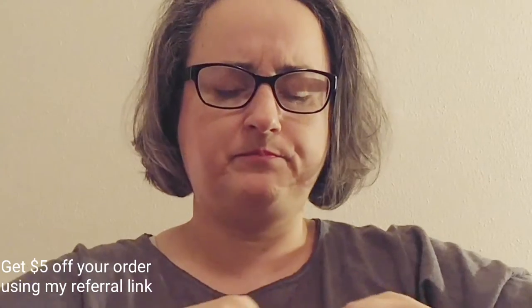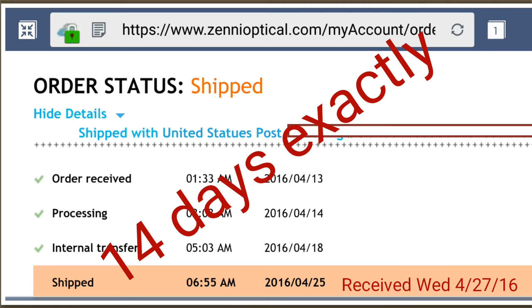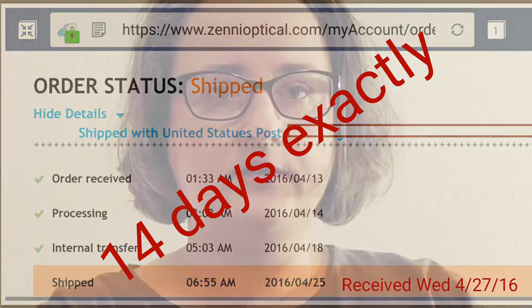It took a little over two weeks for me to receive these after my order. There's nothing in there but the glasses. This is my third pair of Zenni's.